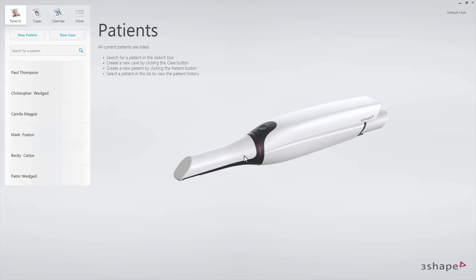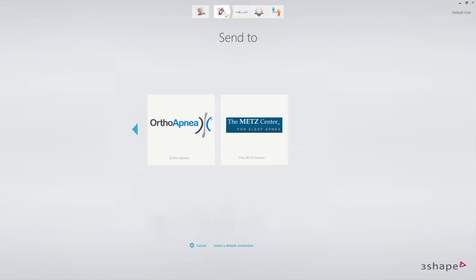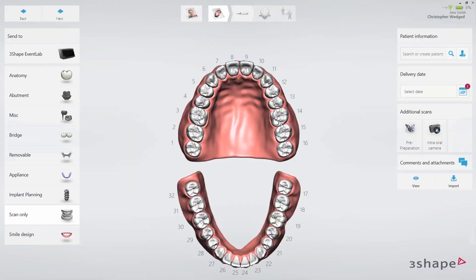Select the New Patient tab or choose the patient from the list and create a new case. In the Send To page, select the chosen Oral Sleep Appliance Provider. On the order form page, choose Scan Only and click Next.